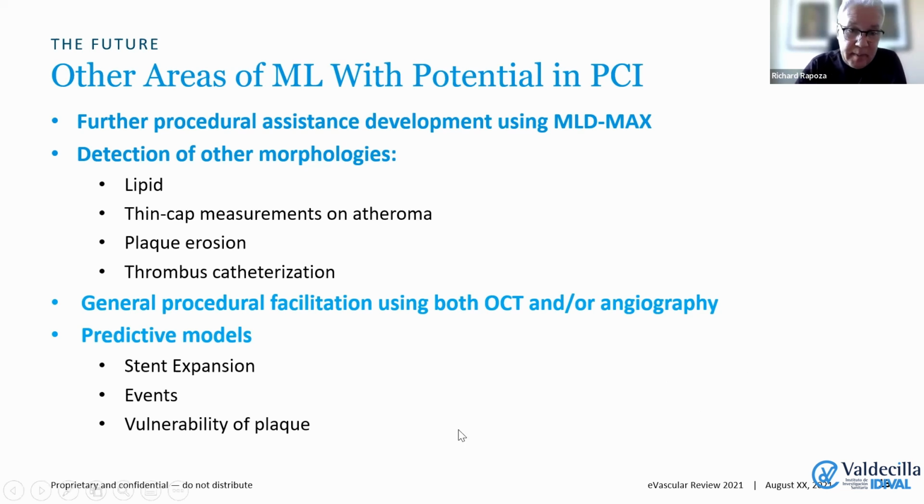The first one here is stent expansion. You can do a more basic stent expansion model that is more or less related to calcium itself and how calcium expands. We suspect that calcium is 70% of the equation when it comes to expansion. And this would lead to something that, for example, tells you this lesion with a workhorse stent is treatable without any predilation. So direct stenting is fine, you'll get 80% or greater. You can set the percent to whatever you think is good. If you like 75%, you can put it in and it'll tell you this will expand to 75% with X% probability.